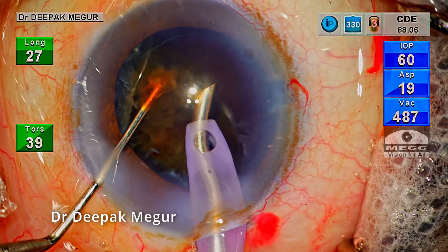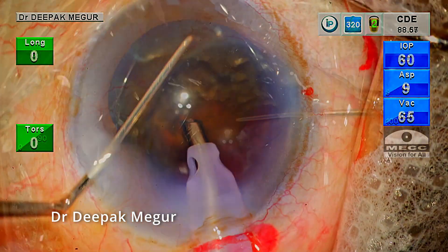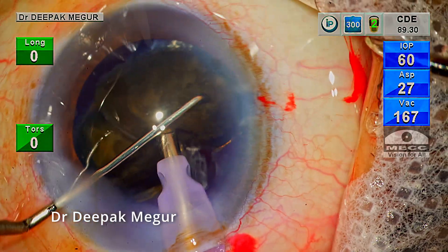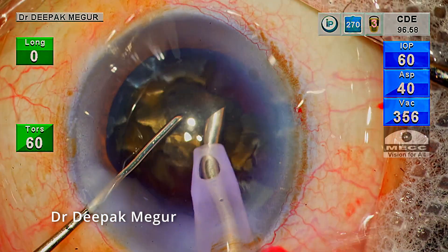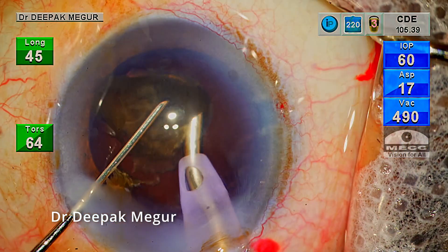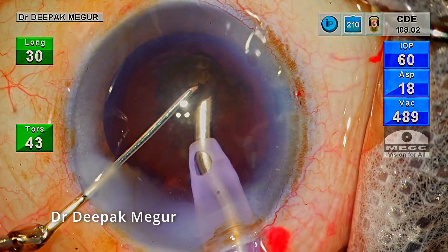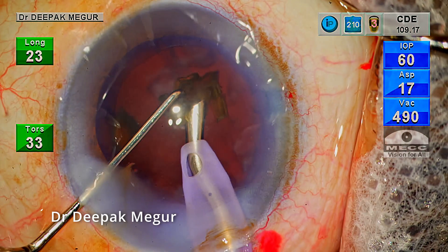OVD is reinstalled — dispersive first, followed by HPMC underneath it. This quadrant is again consumed in the pupillary plane in a very controlled manner. At the end of emulsifying each quadrant, I make it a point to go back and refill the OVD. The last two fragments are not totally separated from each other; the lens fibers holding them together need to be addressed. Once the fibers are eaten off, the two fragments are separated and each is taken care of one by one. The most important criterion is to ensure there is no lens chatter and turbulence. I'm minimizing turbulence and chatter by controlling energy delivery via foot pedal, so that emulsification is done in a very controlled manner at the level of the pupillary plane.